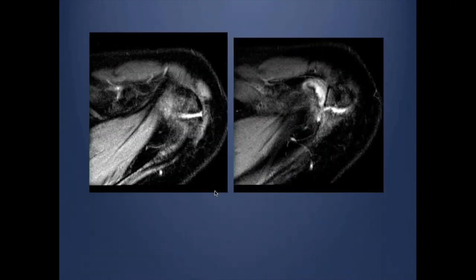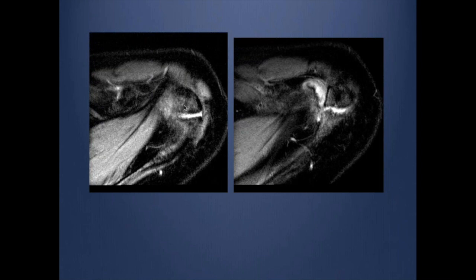Os acromiale is a non-united ossification center at the tip of the acromion. It is very important to mention, particularly if you see a fluid cleft between the os and the underlying acromion, as this indicates pseudoarthrosis and movement of the os acromiale. Every time the lateral deltoid head contracts, it pulls the os acromiale — which is freely mobile — and pushes it against the supraspinatus, resulting in underlying impingement. It is best seen on axial images, especially when a fluid cleft is present.